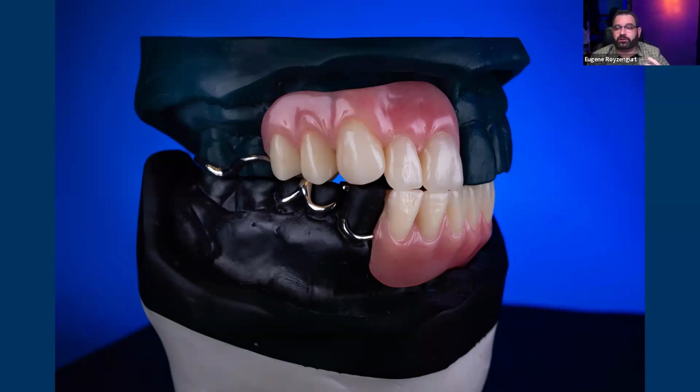However, let's say, for example, you get a scan from the clinician, or if you're a clinician yourself and you're doing a partial framework, so something that needs to be perfectly fitting and needs to mimic as close as possible to what's in the mouth, then I need a resin that's going to be nice and stable over a long period of time, and that's going to give me the best possible outcomes for those things, okay? Now, be aware of certain things.